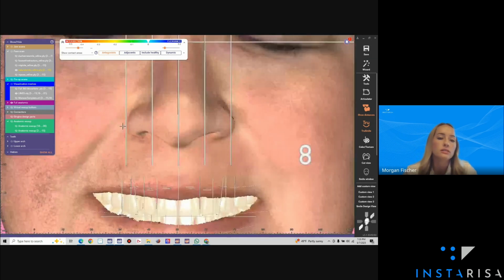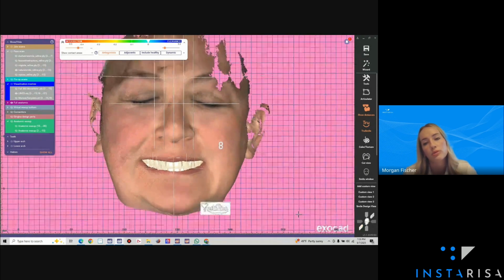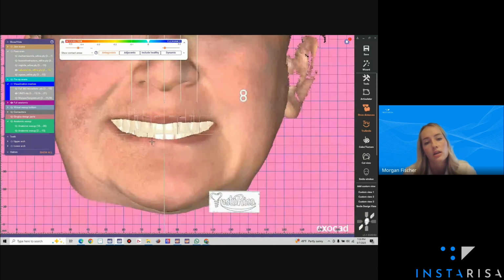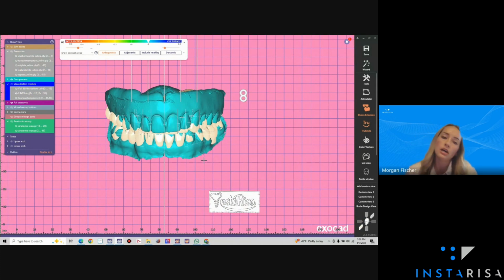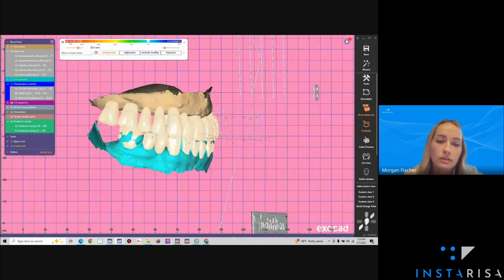So I'm seeing it right on the outside of her nose here. I'm making sure that we're kind of at the inner canthus of the eye on both sides, and it's fitting her face. There's no tilt here. Because this case is going to be lower crown and bridge, I don't have a lot of leeway as far as curve of Spee goes, because we're putting crowns on the lower.